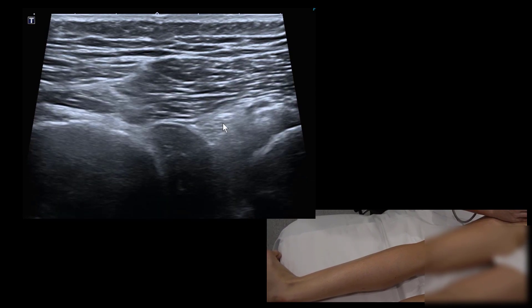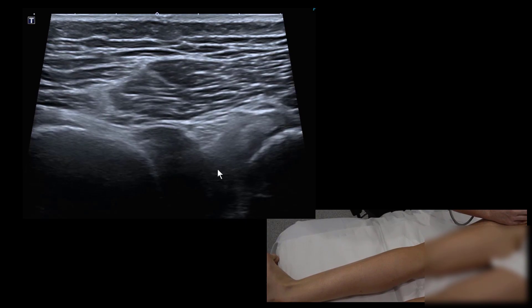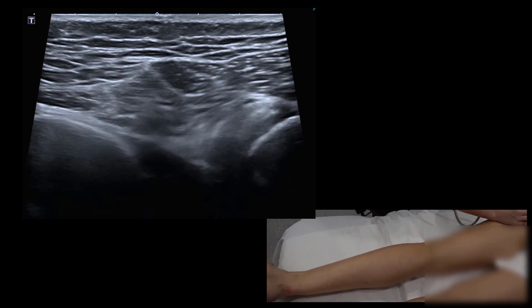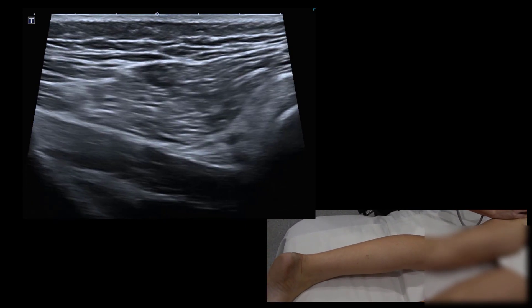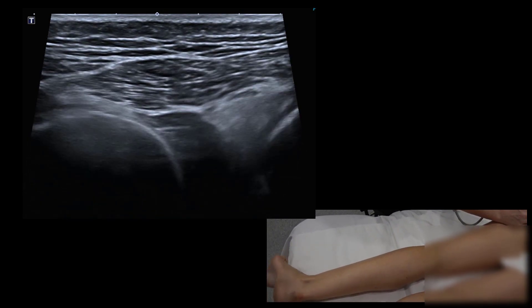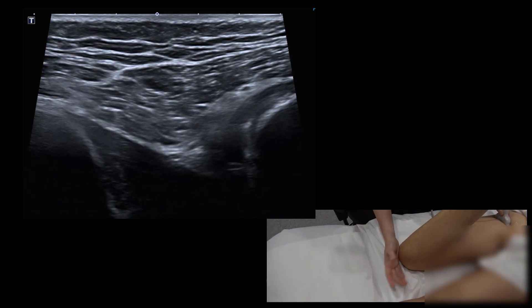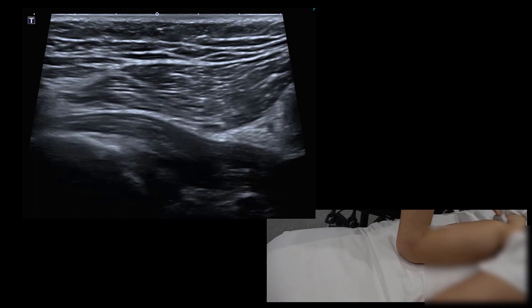We can see the hamstring margin, the sciatic nerve, and the quadratus femoris bulging up. We can also ask the patient to flex at the knee to perform the same assessment — swapping hands and bringing the foot out to open and close the space.